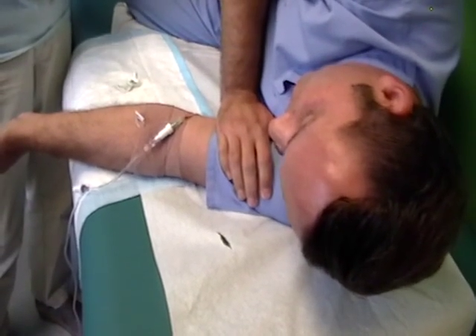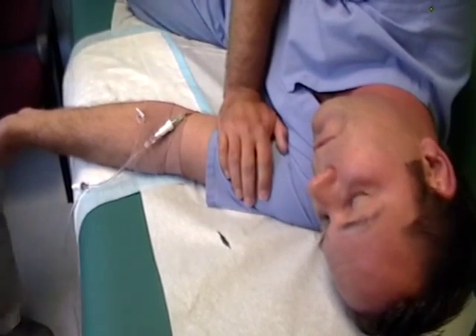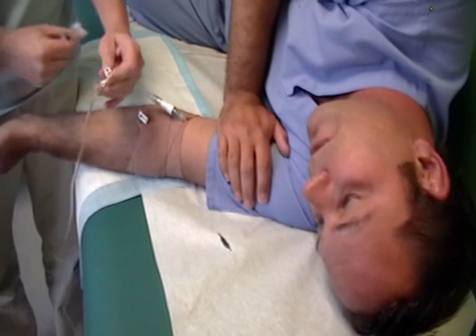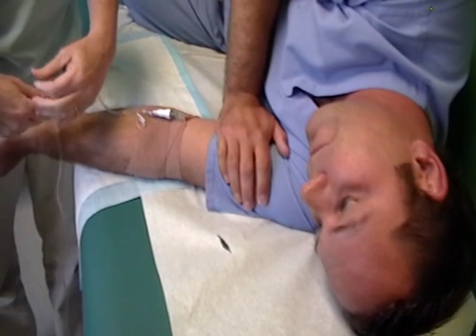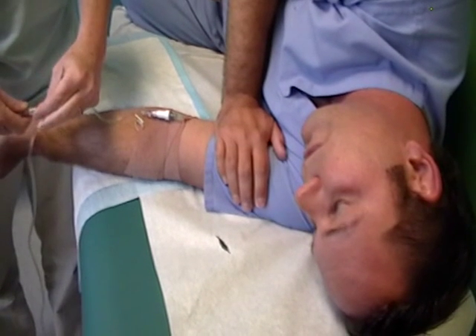Here in a small pediatrician's office where we're not doing IVs all day every day, we don't have the really expensive IV pumps, so everything's got to be given via a push. Pat has prepped the port — this is just a luer lock port — so she's going to screw it in. Now you're going to see she's clamping off the upstream flow, and she's going to push it slowly.